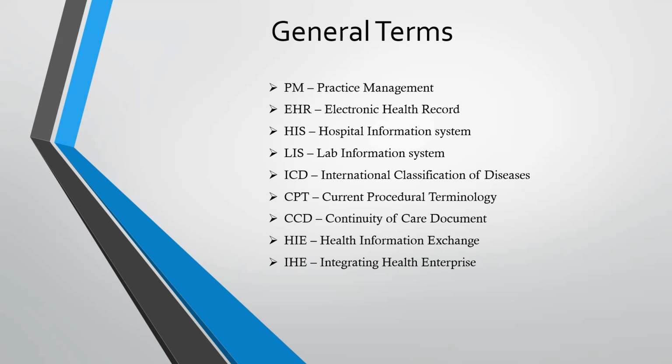Next, you have EHR. EHR is electronic health record. This application is used by many different providers, who are nothing but clinicians, doctors or nurses. So apparently, this application is used to maintain the clinical data of the patient. Mainly you will see this software on the doctor side of the hospital.